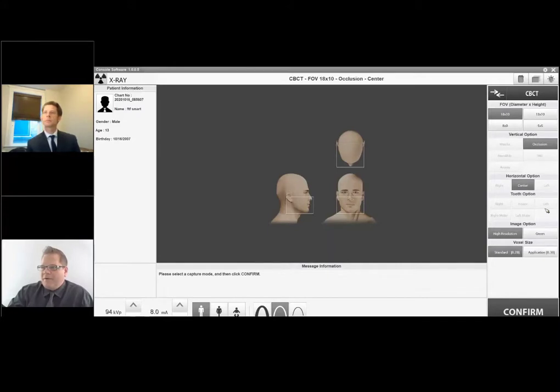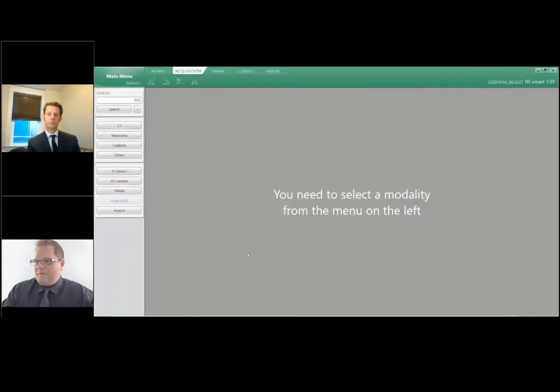What brand of markers are you placing on that denture example that you displayed? Gotcha. So the dentures we worked with, those are SureMark markers, specifically what we had reviewed there. And you can get some more information from us on that.